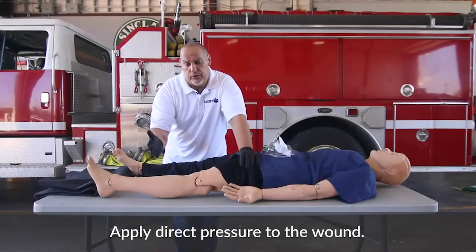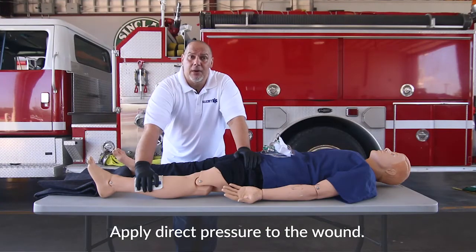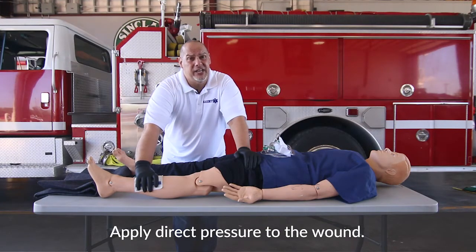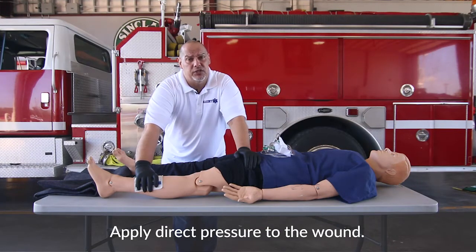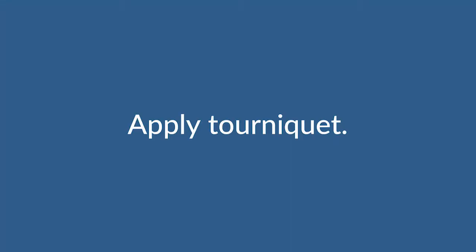This may be a skill that you'll need a couple of hands to do. So you may want to pass that off to your partner so they can continue to hold direct pressure as you're applying the tourniquet.